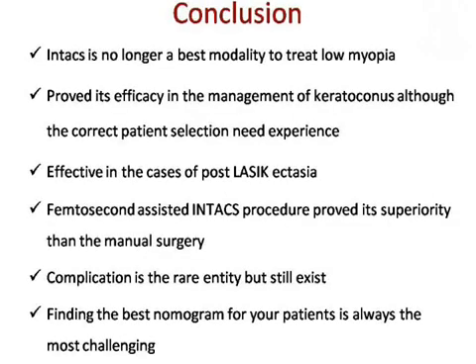In conclusion, INTACS is no longer the best modality to treat low myopia. It proves its efficacy in the management of keratoconus, although correct patient selection needs experience. It is effective in cases of post-LASIK ectasia. The femtosecond-assisted INTACS procedure proved its superiority over the manual surgery. Complication is a rare entity, but it still exists. And finding the best nomogram for your patient is always the most challenging. Thank you.